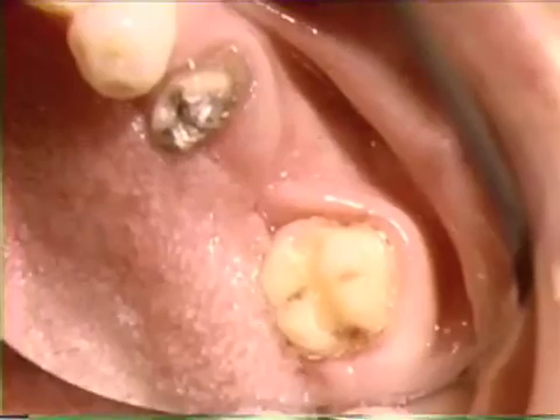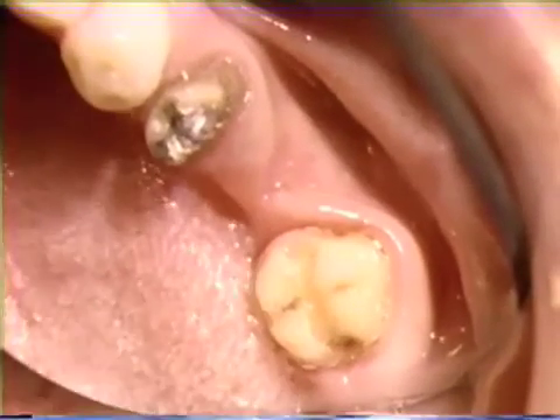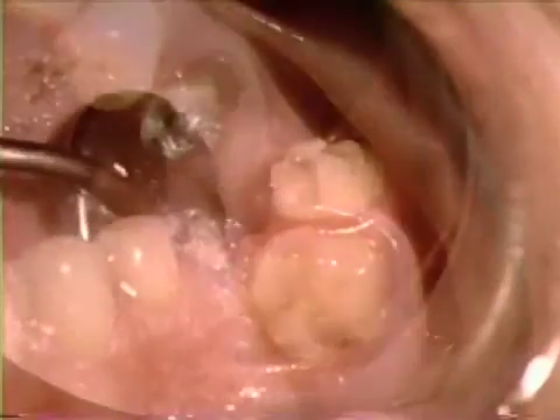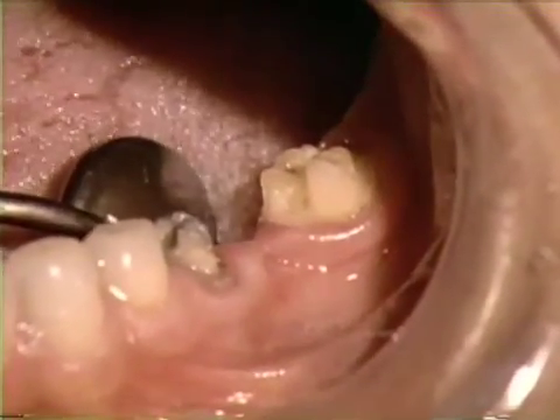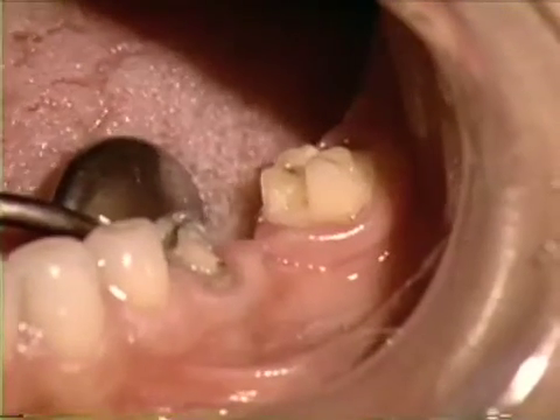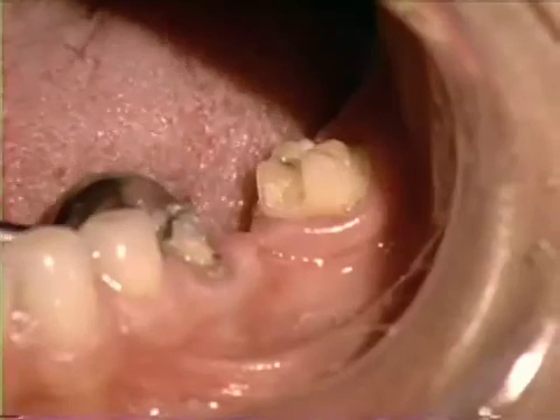This program has presented a basic explanation of the electrosurgical instrument and principles of its use and demonstrated several clinical applications. With practice, the dentist will find electrosurgery to be a valuable adjunct to clinical practice.